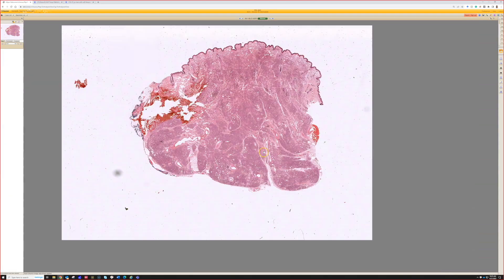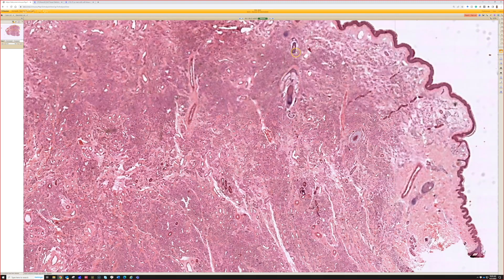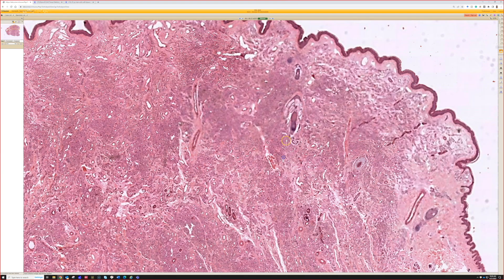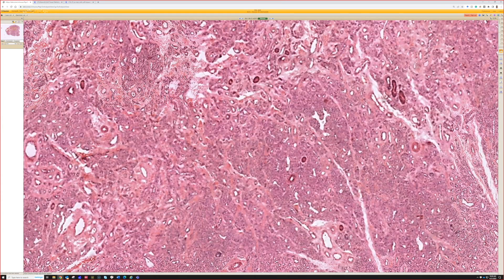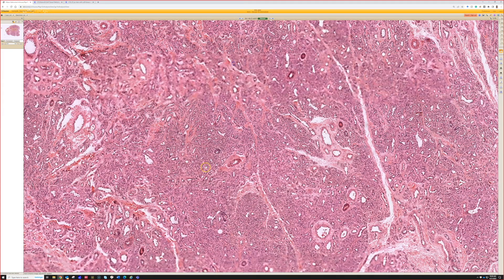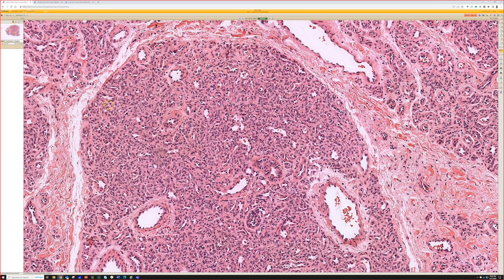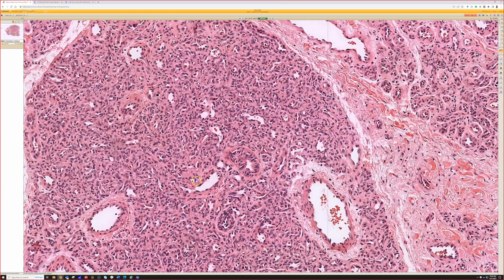It's so busy and cellular — the whole dermis, the whole subcutis is filled with this thing in these big lobules filling up all the space. But of note, look — it fills all the spaces, yet we've got pre-existing structures that are left intact. The eccrine ducts, coils, and hair follicles are just hanging out in between the lobules. The vascular spaces grew around the normal dermal structures and puffed up into lobules like balloons. In fact, in this lobule right here, there's an eccrine coil right in the middle.